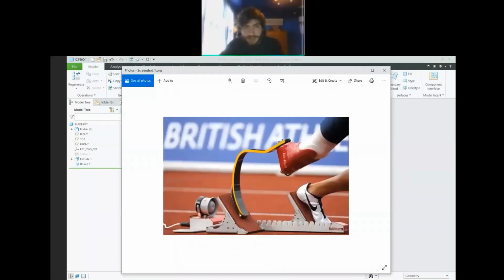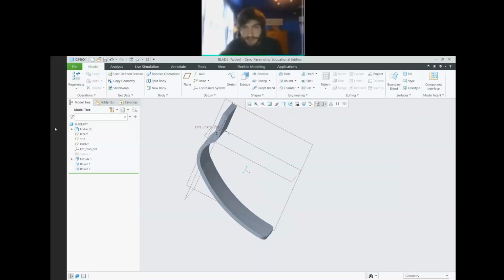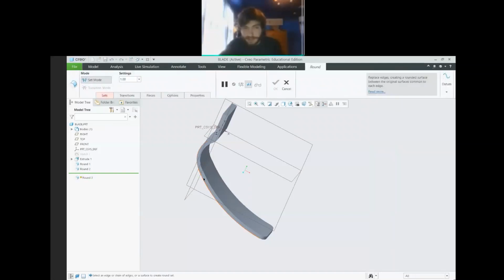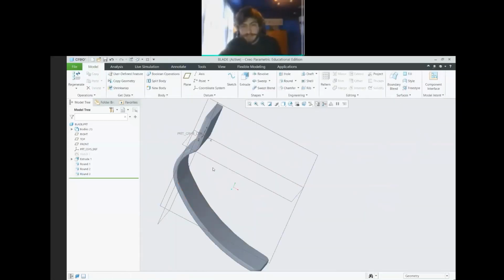The other thing I see, right, is the front of this is also a bit rounded. So we can do that. Again, probably even the same dimension. Nah, I don't like that as much. One's good enough there. And sure, if you want to go crazy, you can even sort of round these edges, right? Something small, like I don't know, 1/8 of an inch. And we can sort of round the whole deal. Right, and just to get rid of the sharp edges on the end.